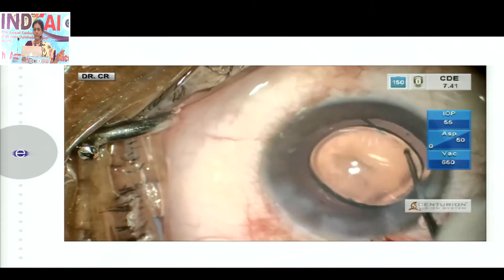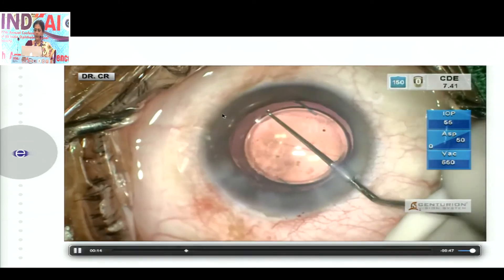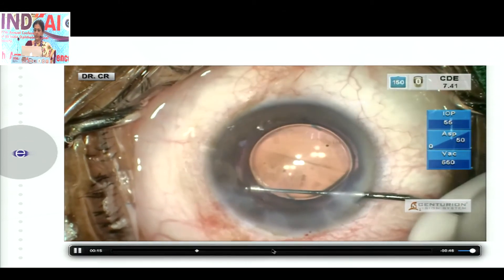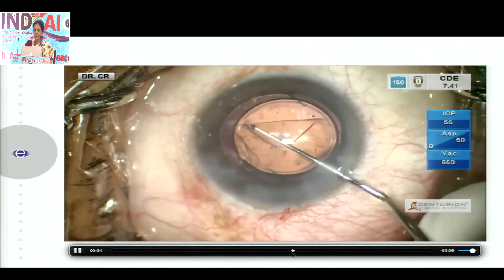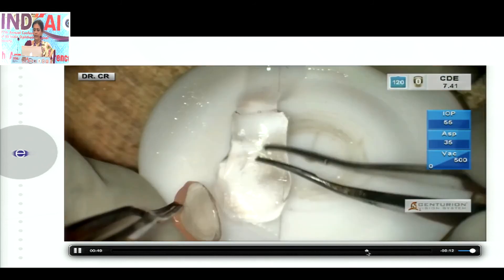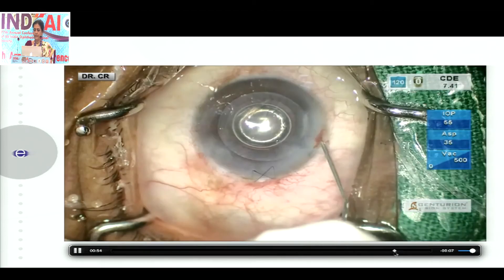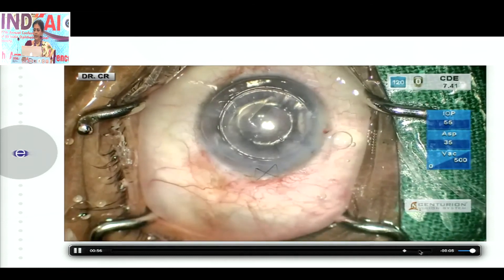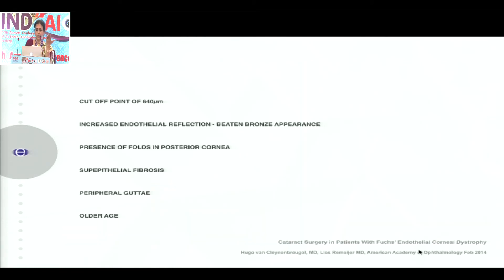Place your IOL, and then all you need to do is score out the Descemet's membrane with the endothelium, use a Sheets glide, place the DSEK graft, and close the eye with an air bubble, which ensures proper positioning.